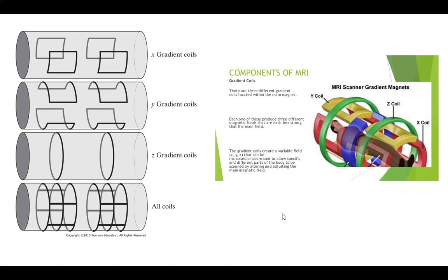These are usually set in combination with also the RF coil, because for instance, you got to keep these constant when you're giving those initial kicks, right? Otherwise, you're going to cause some problems. It's got to be constant during readout. It's another key aspect of them. The 180-degree kicks when we flip or invert stuff is going to flip or invert whatever we're doing here too. So we got to take that into account also when we're reading them out. That'll become important when you're seeing the pulses.